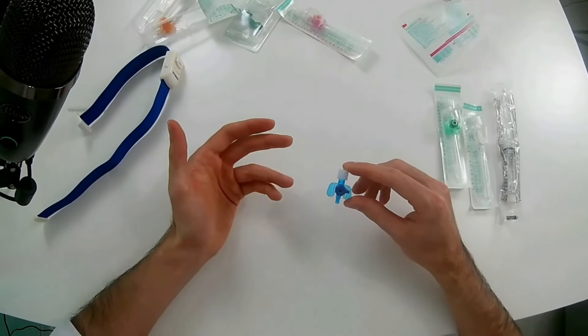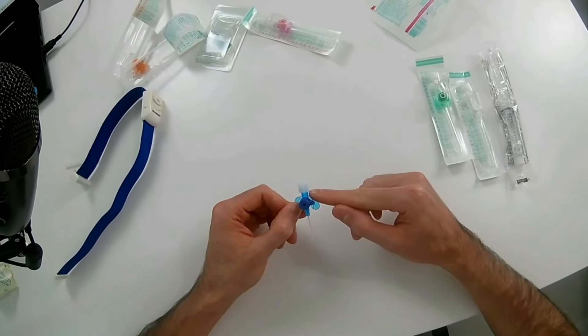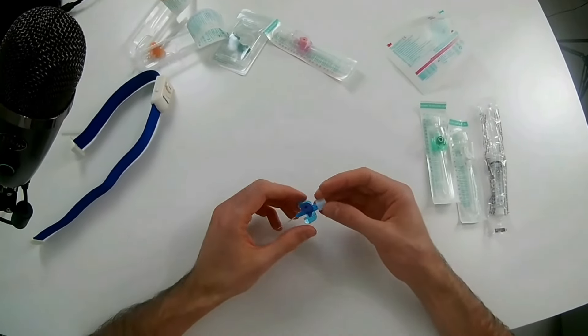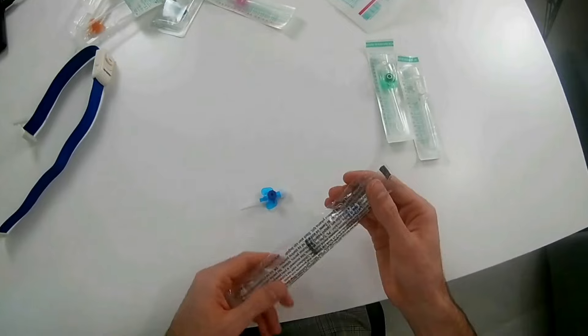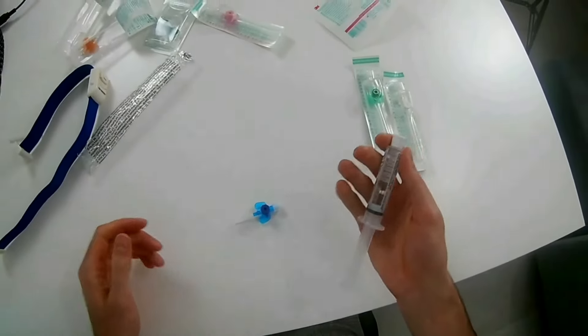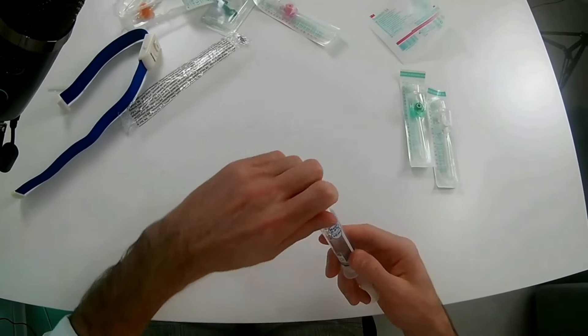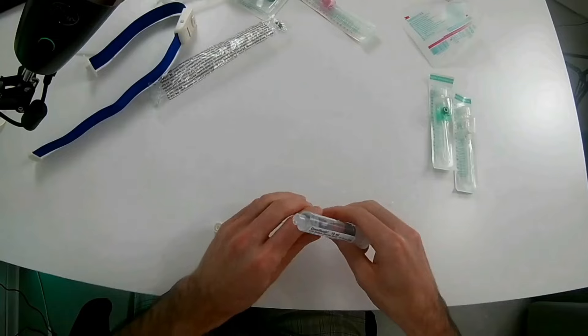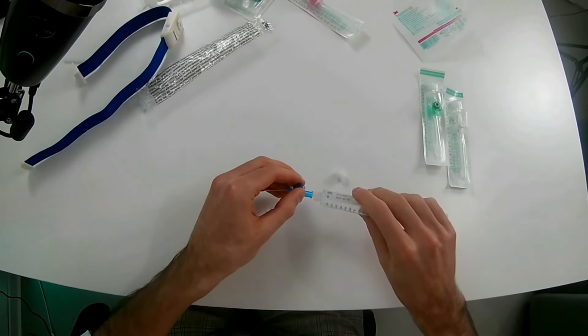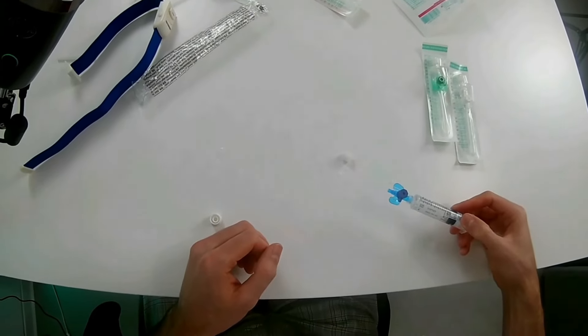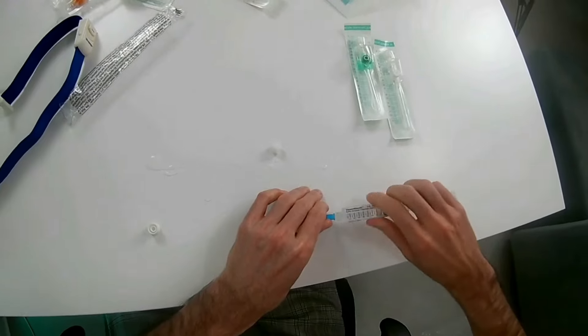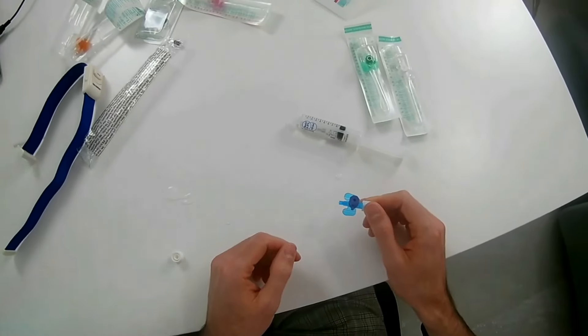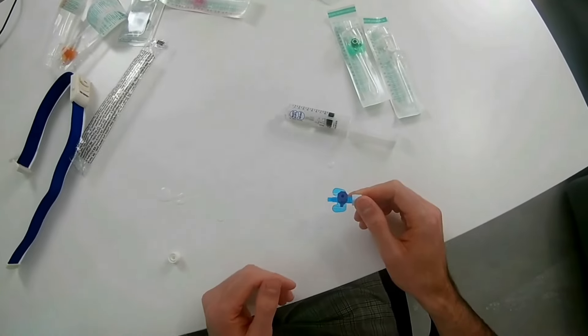Also very important, if you cannot connect it to a system and you want to put the cap to close it, this will be full with blood and you could not just close it because the blood in there would clot and then you cannot use the catheter anymore. So ideally you would use one of these. This is some sterile sodium chloride infusion, some saline, that you could press, open it, and then press again, take it out, and finally close. So in the system you would only have sodium chloride and there would be no risk for clotting inside of the catheter. Now let me take care of this mess.